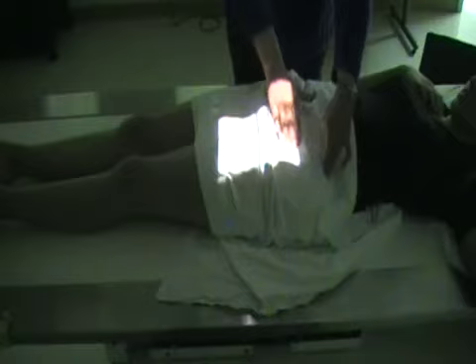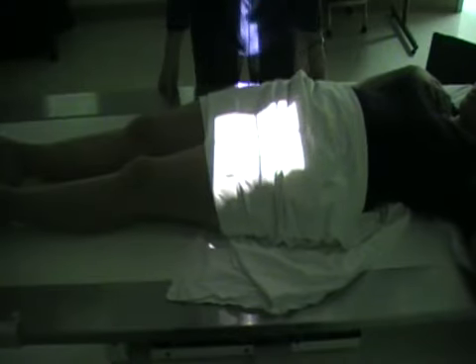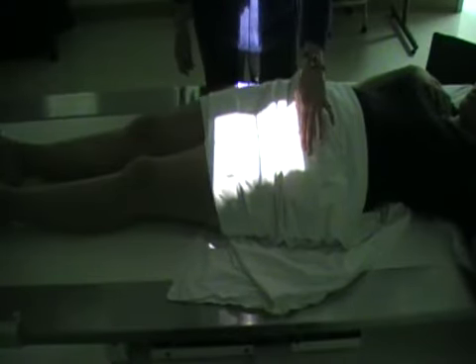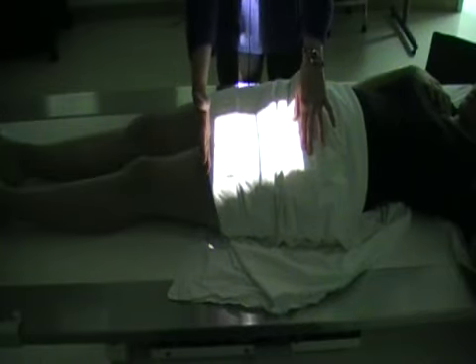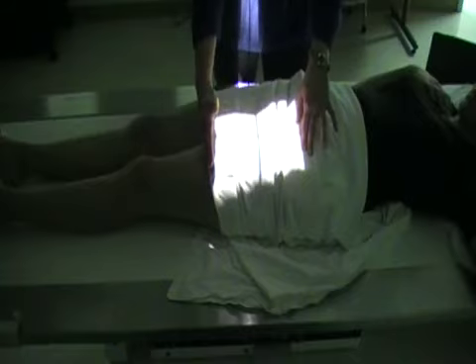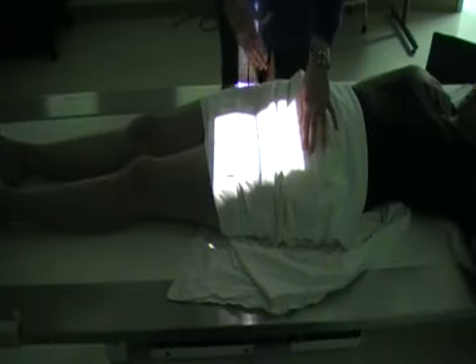Now, when you palpate the ASIS, if you put the top of the light field at the ASIS, and we have a 10 by 12 light field, so top of the light, ASIS, it's going to have the proximal portion of the femur on here. It will also include the hip joint.